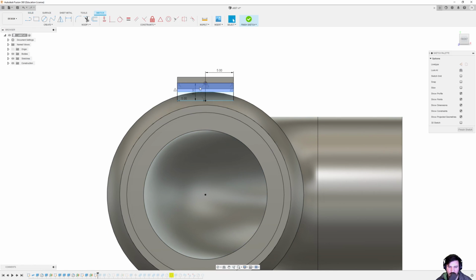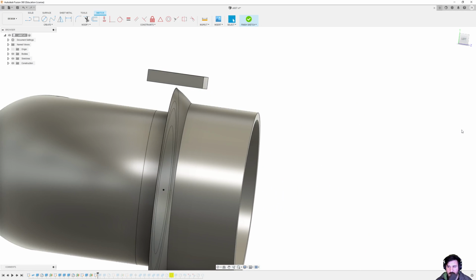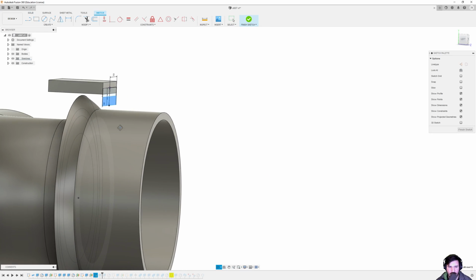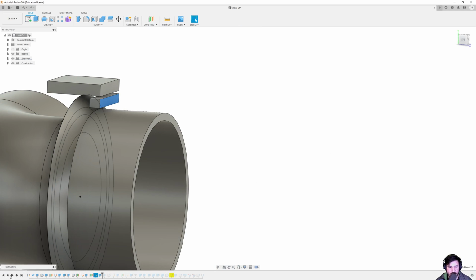So if I edit the sketch, I drew this square right here, which is going to be the piece that actually overhangs. And then next, I extruded that out. So there's a piece there. I don't know why. Oh, I know why. Because if we look at this sketch, I only extruded this piece right here. That's selected in blue. I didn't extrude the whole thing, which is not a problem because I ended up coming in and finishing the sketch. I ended up coming in and just joining the two and making it one big thing. It's just a little bit of a roundabout way to get there.